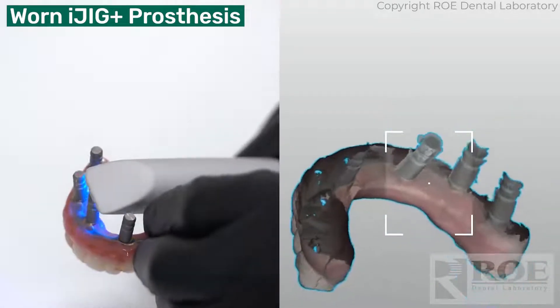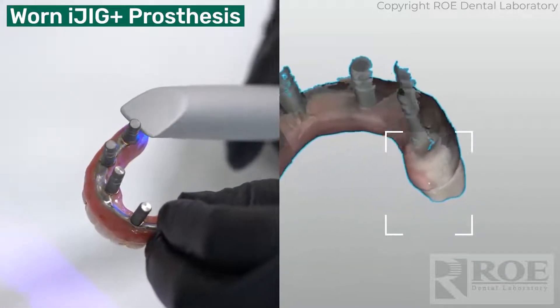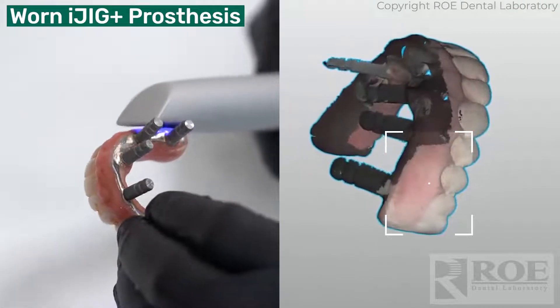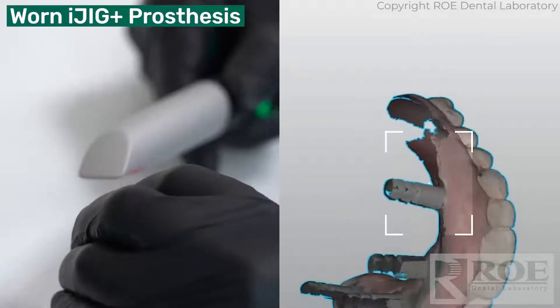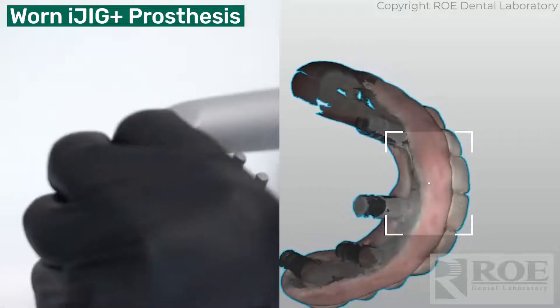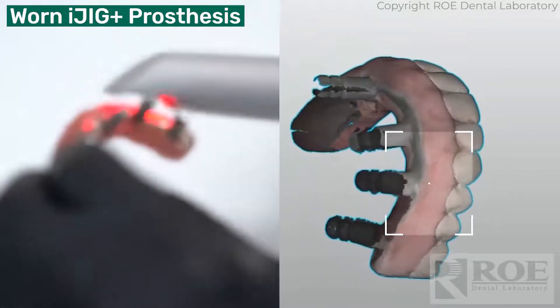Since I'm here, I'm going to go ahead and scan the intaglio. You might be asking yourself: if you scan the intaglio, what about the tissue gap? Well, that's when you scan the mouth — just follow our iJig scan protocol for that part of it. All we really want to do is digitize the prosthesis and have it aligned with the implants.